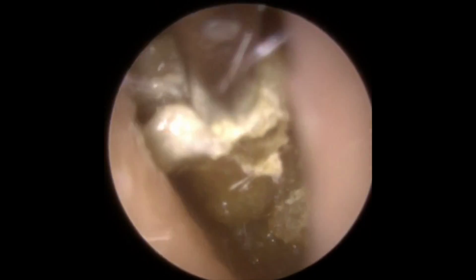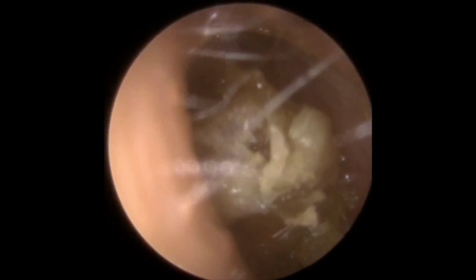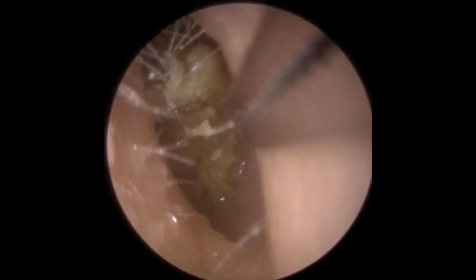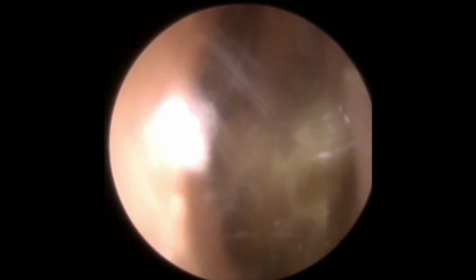So now we've put the oil in, look, we can spin it a lot more effectively. We're bringing this top section down now, so we are getting some good movement. Now the forceps are going to come into play again here, because I want to try and get above and below that little section of dry skin there. I'm hoping we've got enough of an angle to get that out, but unfortunately as we go in to do it, I can see I'm not going to get a good grip. I'm just going to push this further in.